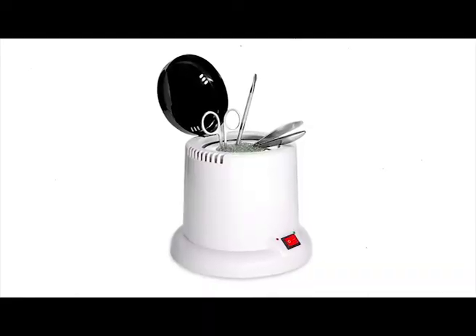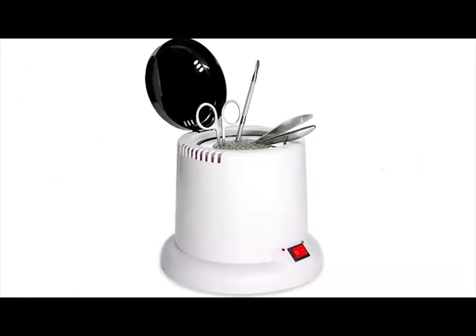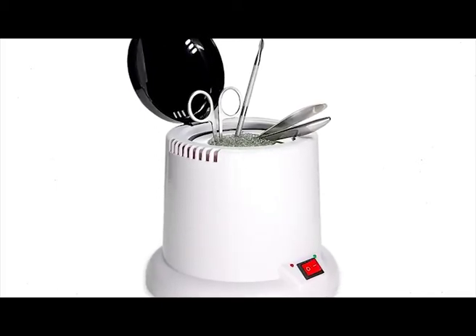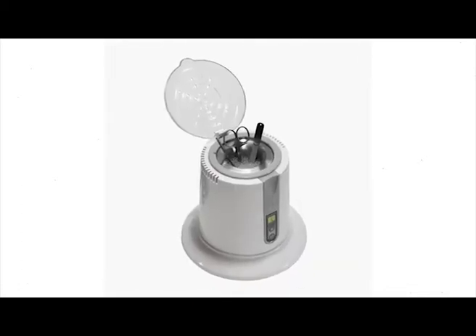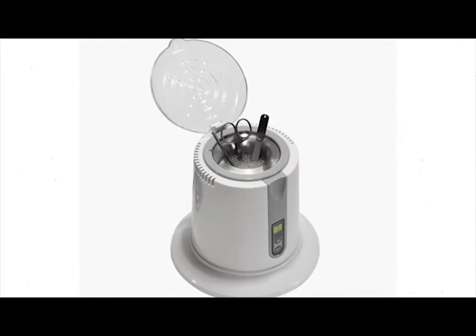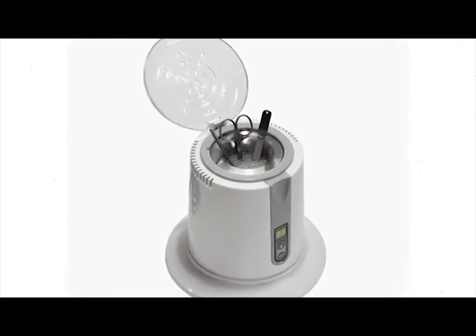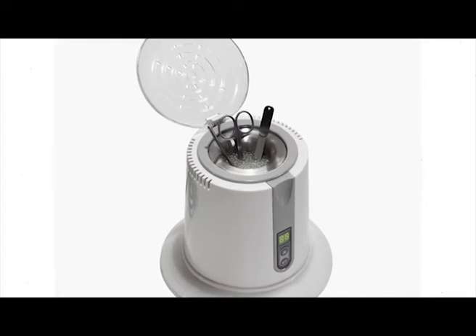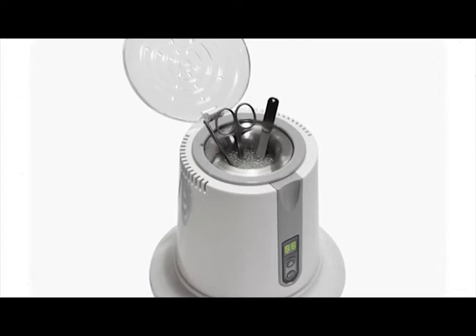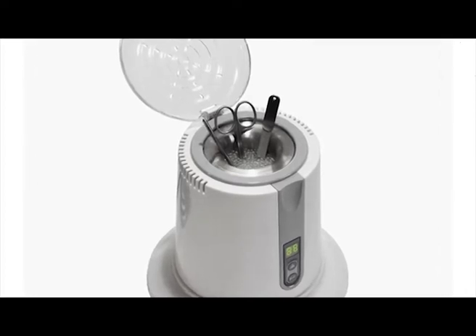Glass bead sterilizers may be used to sterilize instrument tips between rodents when using a single pack for multiple animals. Instruments must be initially sterilized by steam or gas. The tips of surgical instruments are placed into the hot glass beads for approximately 5 to 10 seconds. Blood and tissue should be wiped off the instrument tips prior to placement in the glass bead sterilizer. Only the tips of the instruments are sterilized using this method.